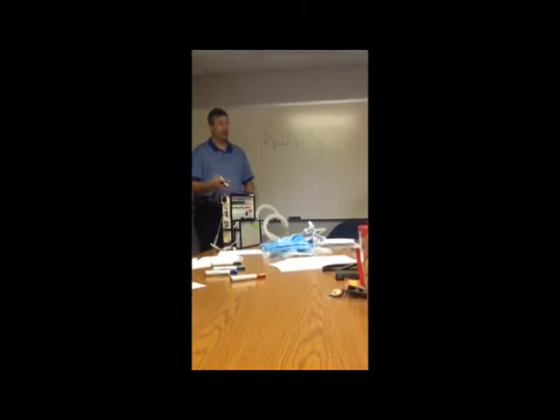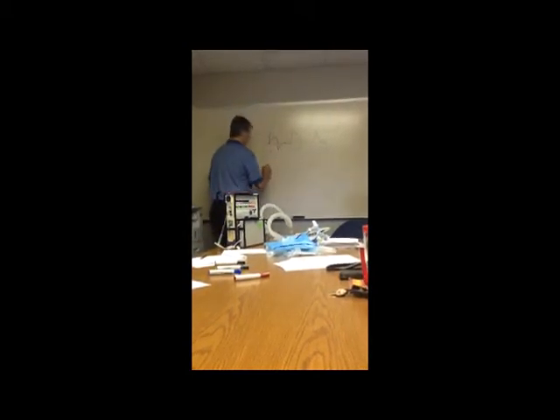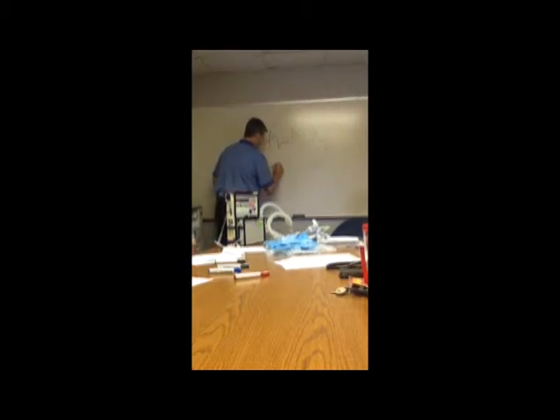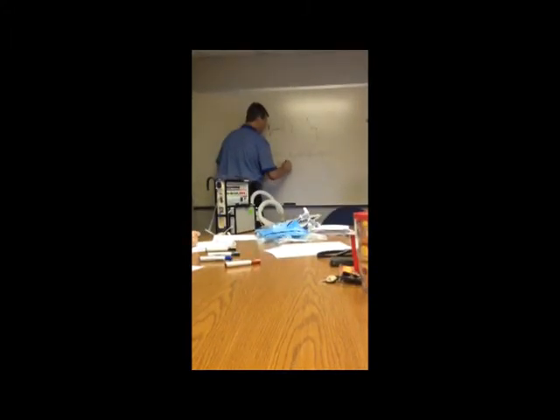And if you have a better understanding of what that is, it'll help you know what to do to fix it if they don't look good on SIMV. Okay, so SIMV, same thing here. Do black. Same as the last waveform. This is pressure. This is time. I'm going to stretch it out a little bit so I can see a little better. All right, and that's time going this way.